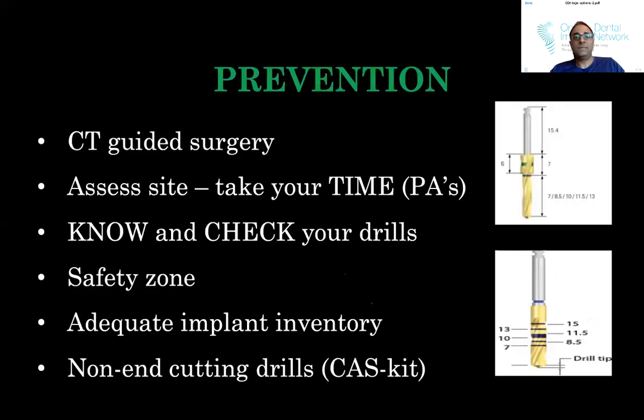So prevention: CT-guided surgery, I would say, is the best way, because you can map everything out right before. But again, it's just a guided surgery, so you still want to be cognizant of what's going on. Assess the site and take your time. So if you have a case where you're worried about nerve issues, take your time, take PAs. Know and check your drills, and you can take PAs with your drills.